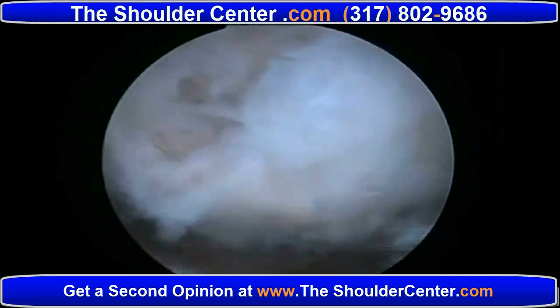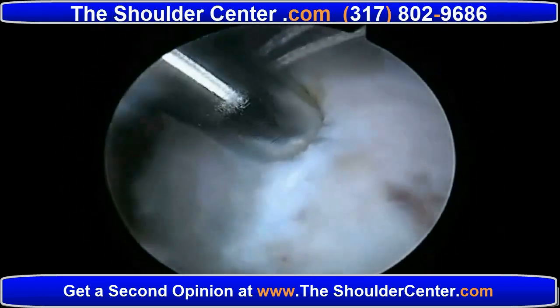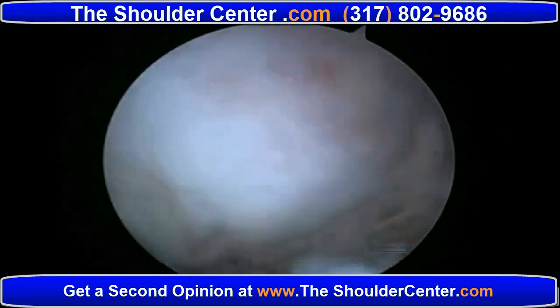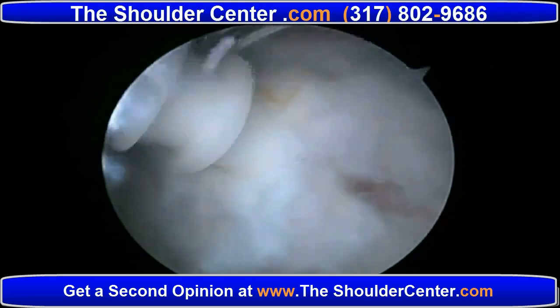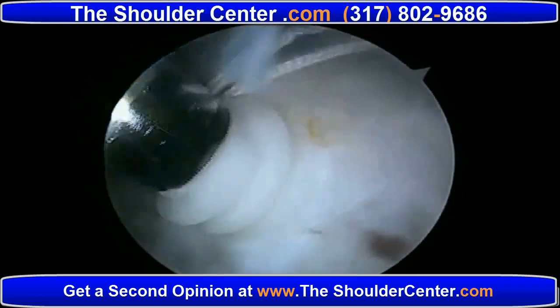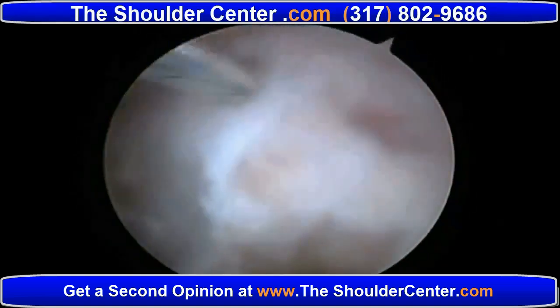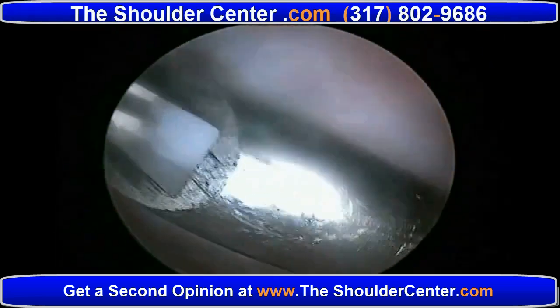Now we move ahead with the tension band portion of the repair. The idea of the tension band is that we want to neutralize the pull of the rotator cuff tendon and create uniform tension. Here we've created a socket with a punch well beyond the footprint, and we're going to introduce a calcium biocomposite triple-loaded rotator cuff anchor. We prefer the triple-loaded anchor because it requires fewer anchors for the repair. The calcium biocomposite also improves the calcium concentration of the greater tuberosity, which also improves the quality of the rotator cuff footprint.